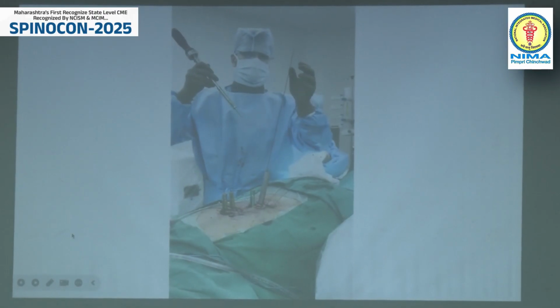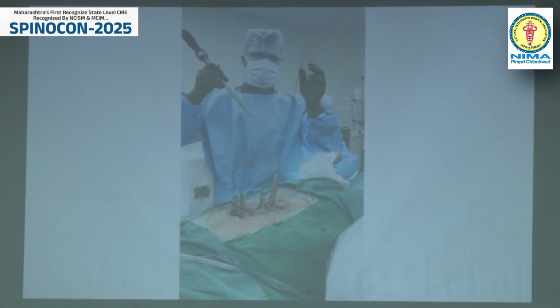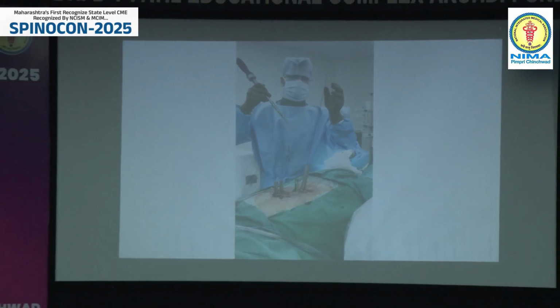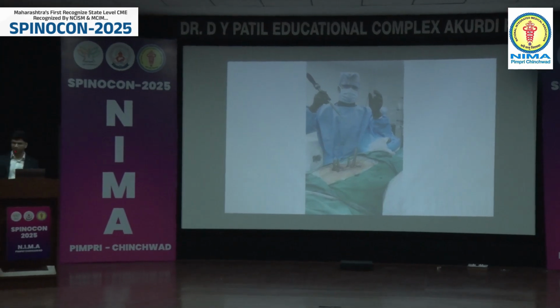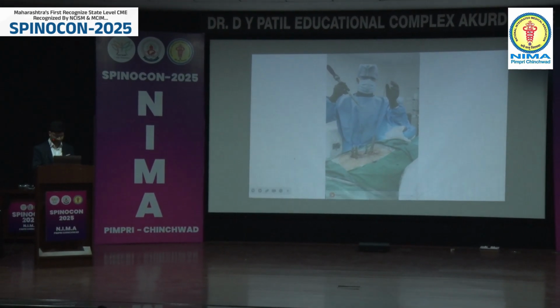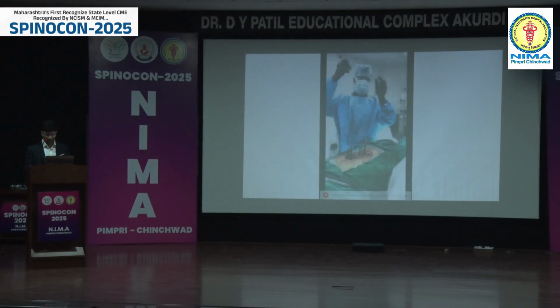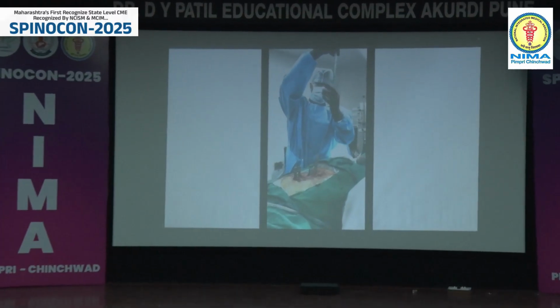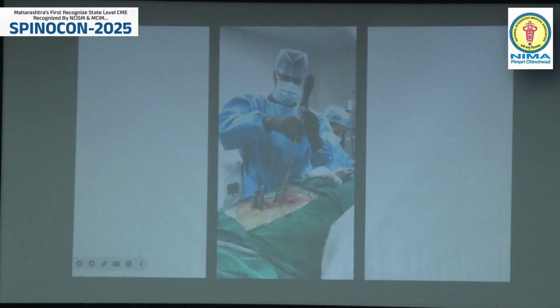Even if the patient needs fixation surgery, if we want to place screws and rods along with the endoscopic spine discectomy, we can do that too using very small cuts, generally 1 centimeter cut per screw. And this is how it is done. So basically, first we place guide wires percutaneously, and then the dilators, you see these dilators here?